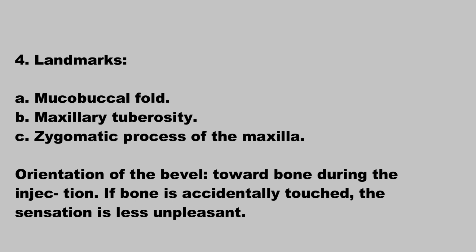4. Landmarks: A. Mucobuccal fold. B. Maxillary tuberosity. C. Zygomatic process of the maxilla. 5. Orientation of the bevel: toward bone during the injection. If bone is accidentally touched, the sensation is less unpleasant.